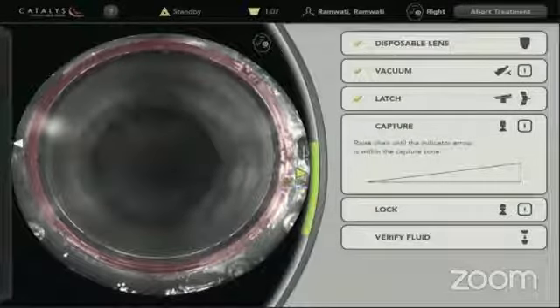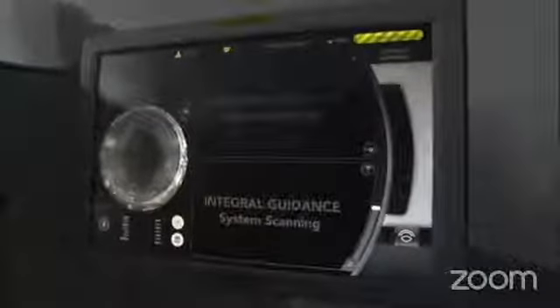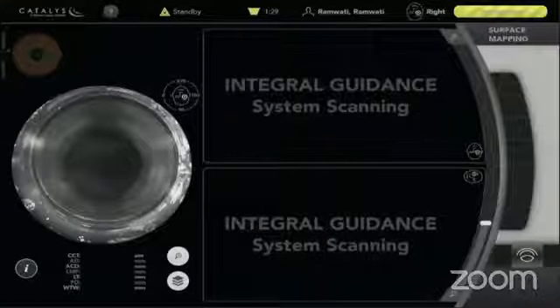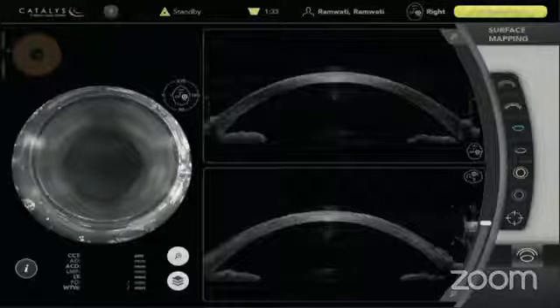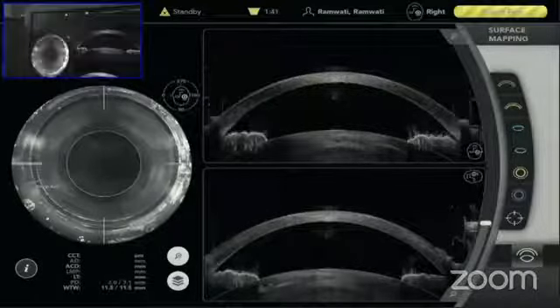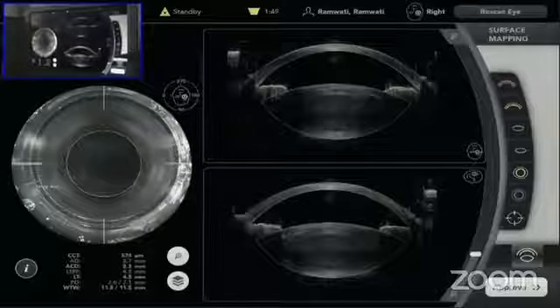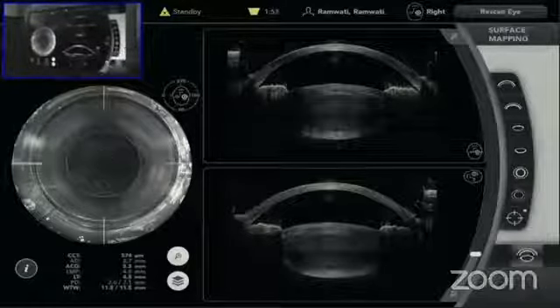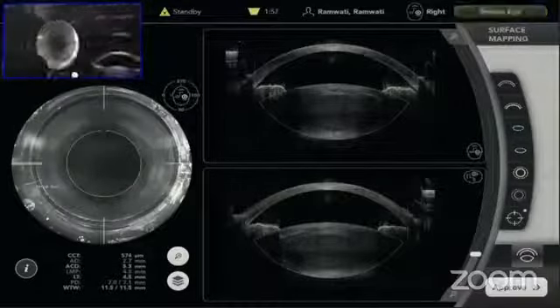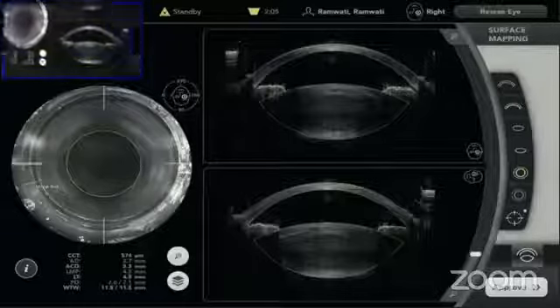We are aligning at 0–180, with the black ring coming to the center of the red ring. We raise it into the green area, press capture, and then go to lock. We bring it again to the green area so there is no friction. The fluid is confirmed. The re-scan — 360-degree scanning — is now happening. This is the front of the cornea, which has to be in the center showing no lateral or vertical force. This shows the posterior cornea, anterior lens, the angle, and the blue is the limbus. You can see it is at 0–180, well aligned. Cyclotorsion compensation has happened and we go on to approve.